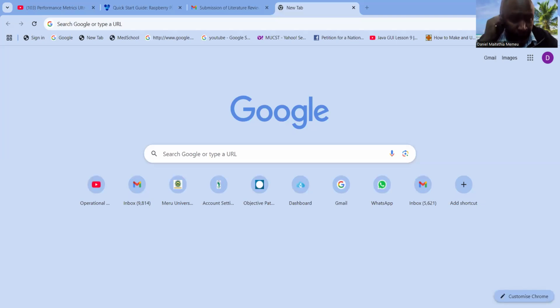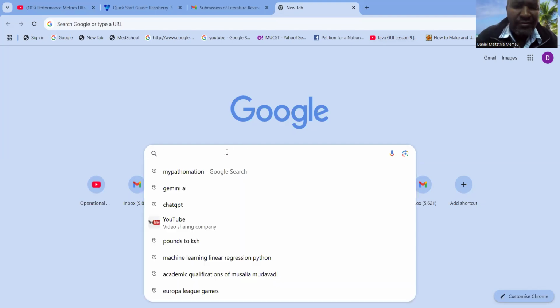So, a short introduction to navigating to my pathomation. You can start from Google search, search for my pathomation.